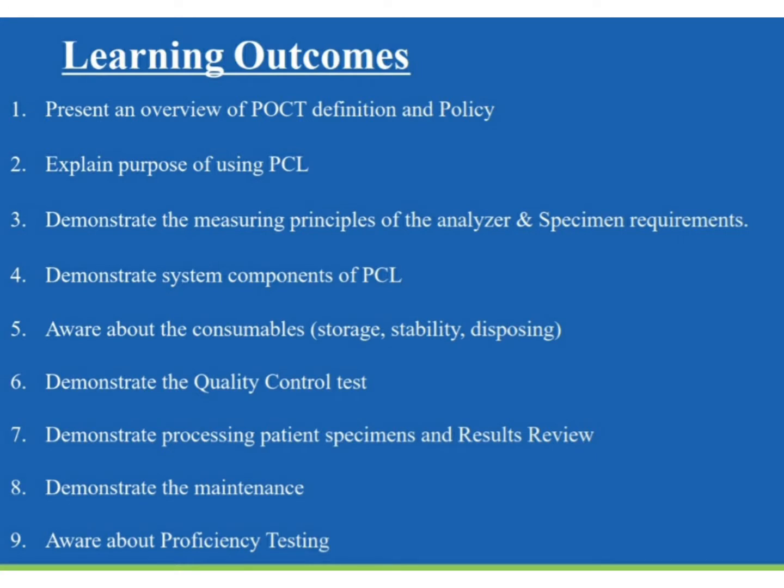Our learning outcomes are to present an overview of POCT definition and policy, explain the purpose of using PCL, demonstrate the measuring principles of the analyzer and specimen requirements, demonstrate system components of PCL, and be aware of the consumables like storage, stability, and disposing. Demonstrate the quality control test. Demonstrate processing patient specimens and results review. Demonstrate the maintenance. Be aware of proficiency testing.